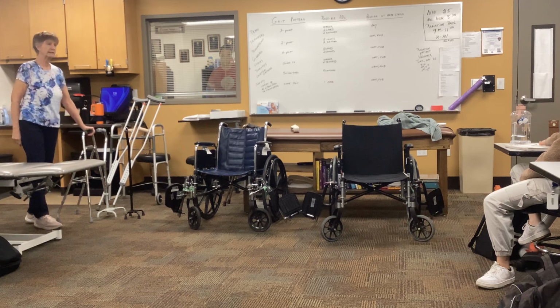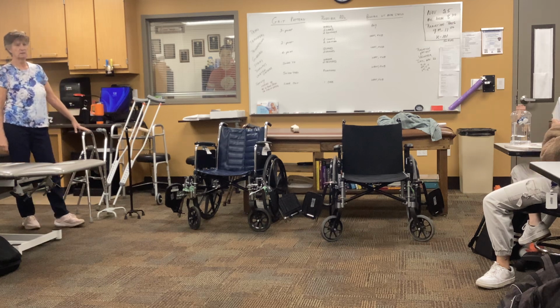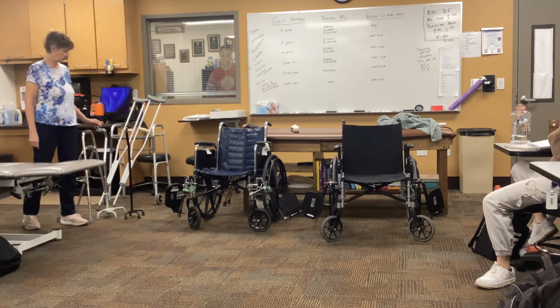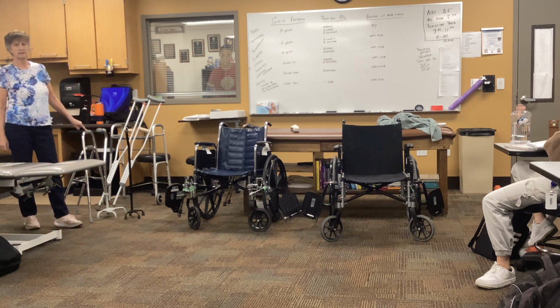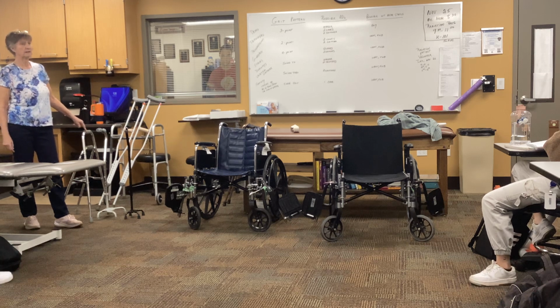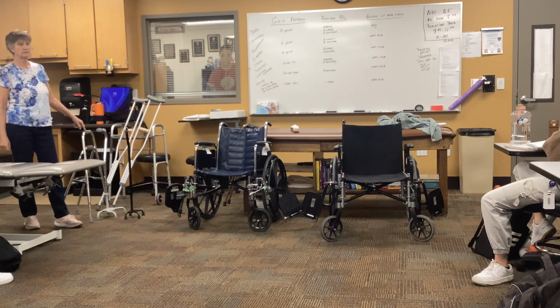Occasionally, you might see somebody with 2 small base quad canes. Rarely will you see somebody with 2 large base quad canes. And if somebody can use 2 of the hemi canes, then they need a walker.